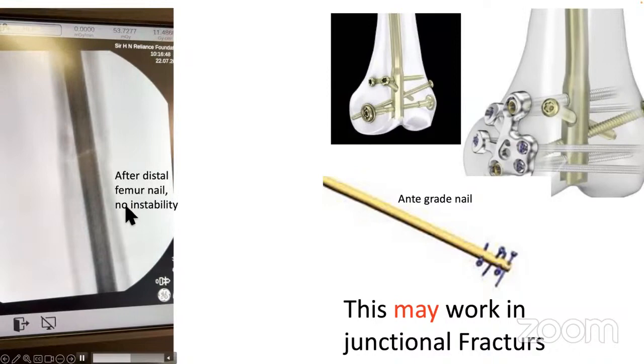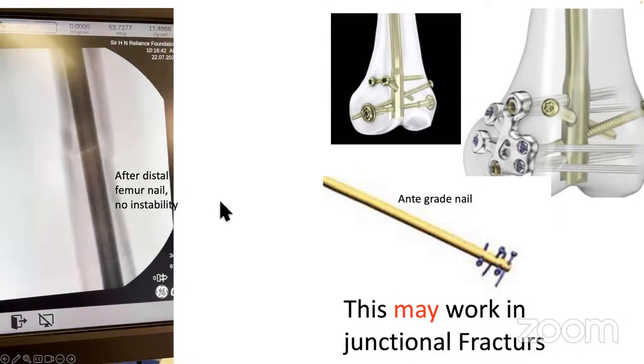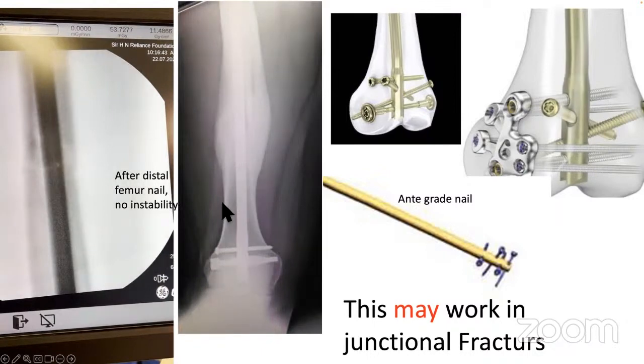But you can see after the distal femur nail, I was doing a video, there is no movement occurring, so I didn't do anything and this healed up very well. But again, not all the time you will be successful. If there is comminution or a wide medullary cavity, this may not still function at times.